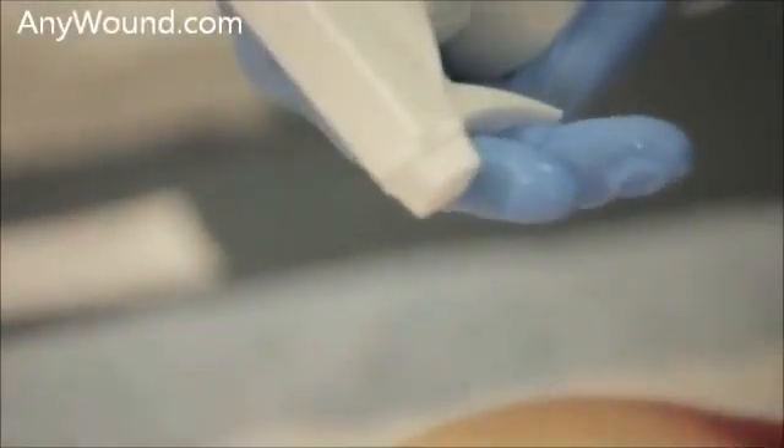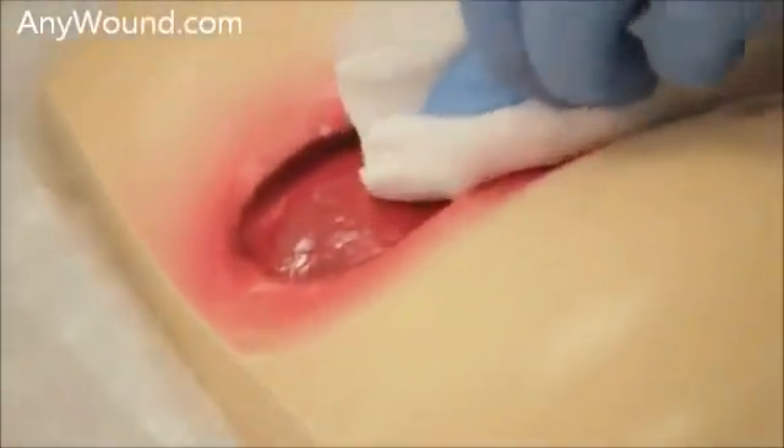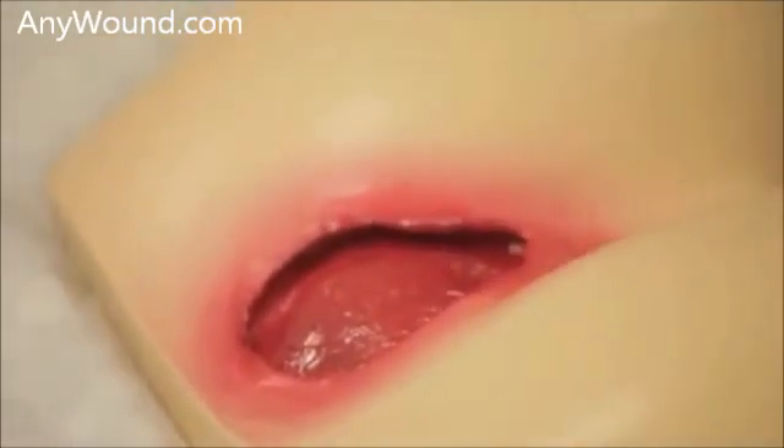Then we'll cleanse the area with a wound cleanser and gauze. We'll spray directly either on the wound or on the gauze, then wiping the surface clean.